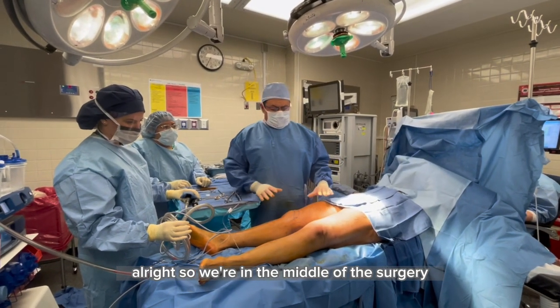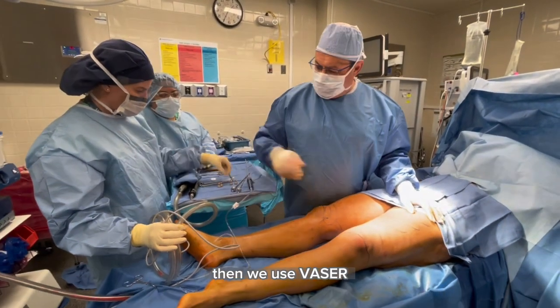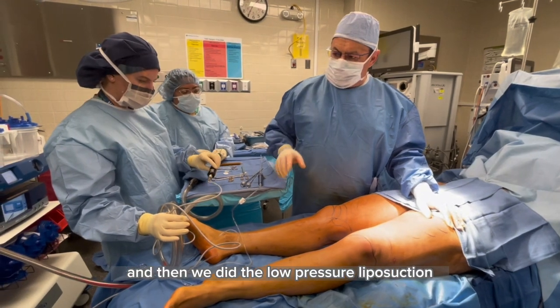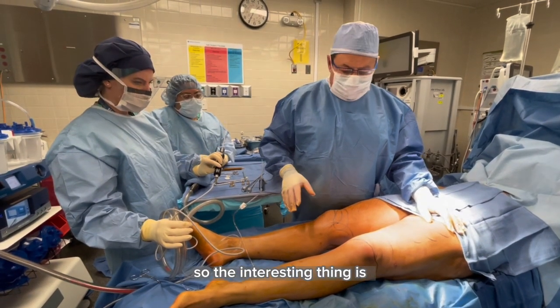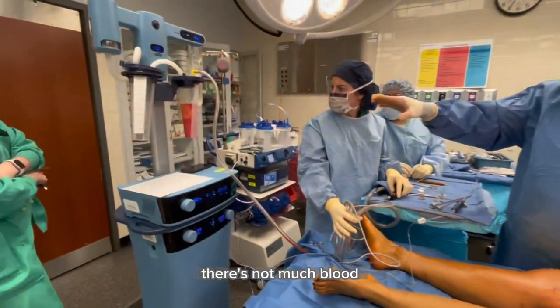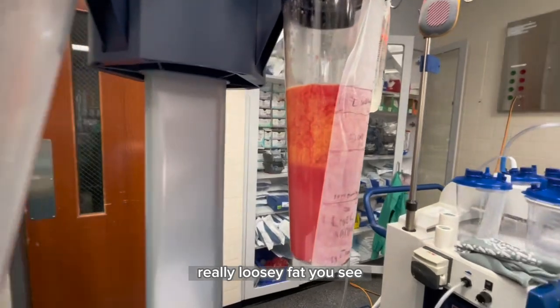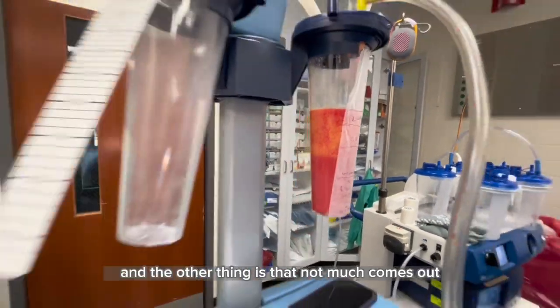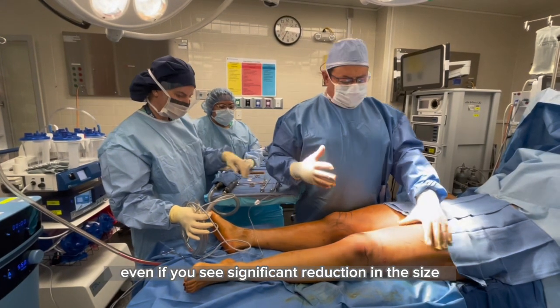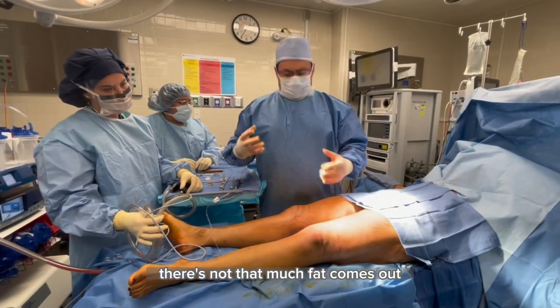We're in the middle of the surgery. I did infiltration of this leg, then we used VASER as you saw in the previous video, and then we did the low-pressure liposuction. The interesting thing is, if you take a look at the quality, there's not much blood — it's all really loose fat. Not much comes out; once you dilute the fat, even if you see significant reduction in size, there's not that much fat that comes out.